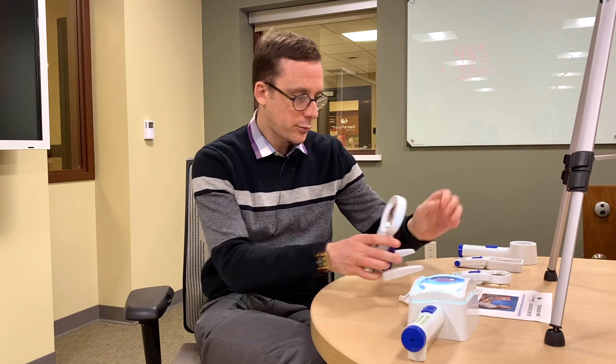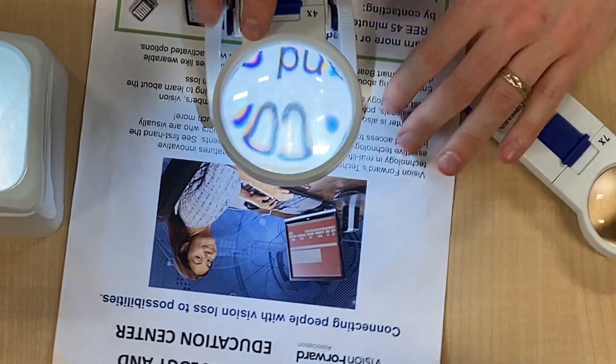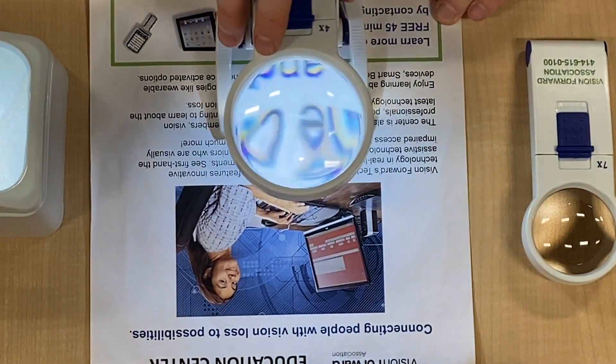You can actually get a little stand to put your handheld magnifier in. We have this magnifier in a little stand at the moment — you rest it on the paper, angle it as needed, turn on the light, and use it similarly to a stand magnifier. The added bonus is that you can take the magnifier out and use it as a handheld when you need to take it on the go. It's a nice flexible solution.